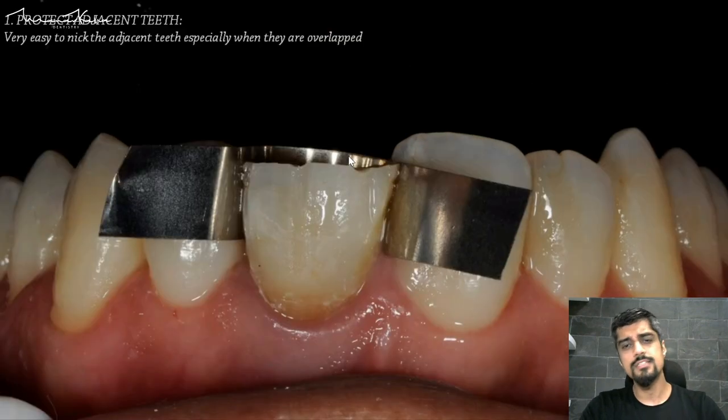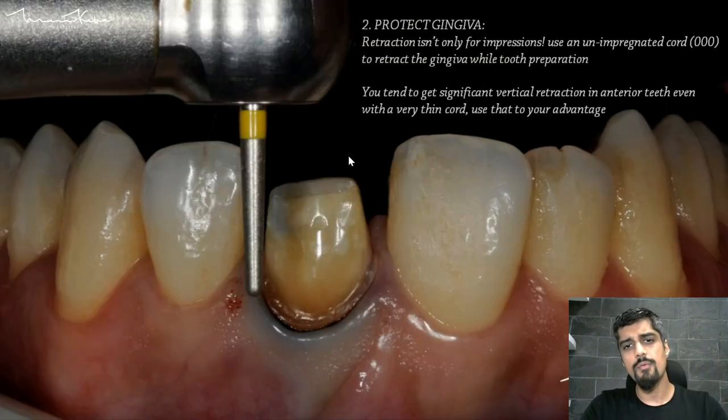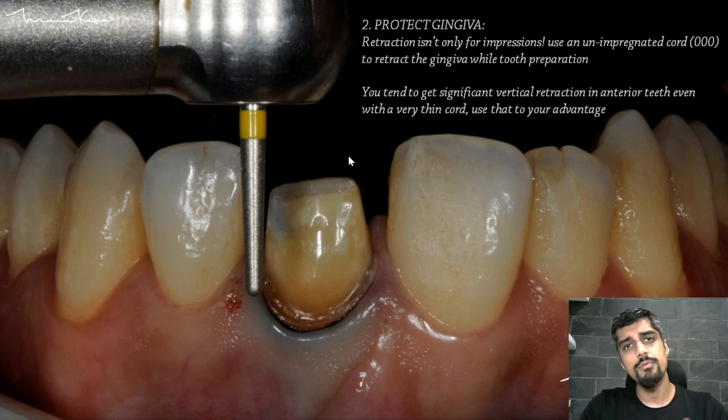This photograph is quite self-explanatory — this is how we protect the adjacent teeth and this is how we protect the gingiva. Remember, retraction is not only for impressions. You can use an unimpregnated cord to retract the gingiva during tooth preparation. Why unimpregnated cord? Because when you are doing tooth preparation, you are keeping the retraction cord inside the sulcus for a significant amount of time.